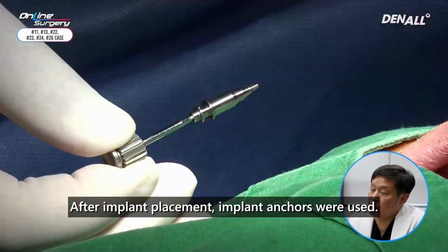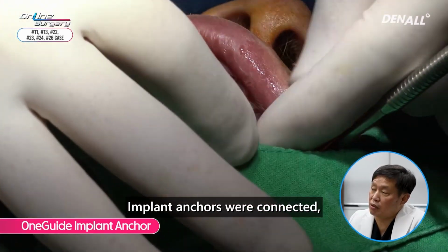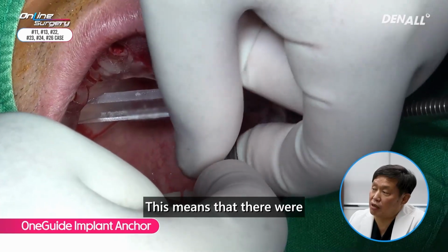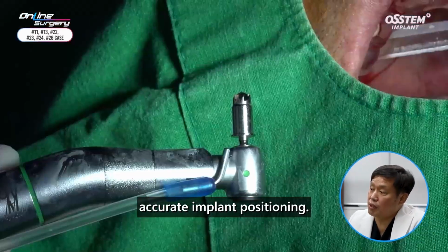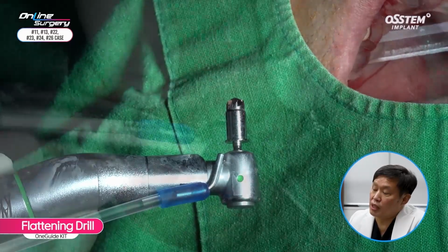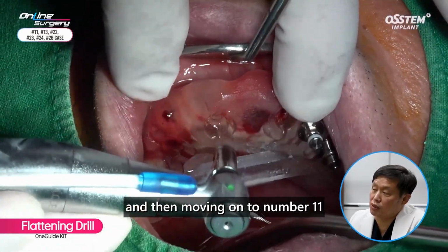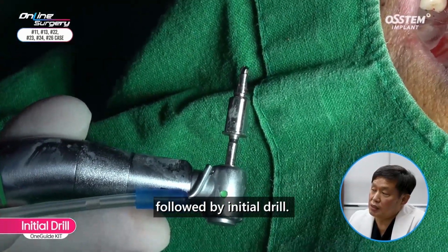After implant placement, implant anchors were used. Implant anchors were connected. Number 3 and 4. This means that there were 2 vertical anchors in order to ensure accurate implant positioning. Template was checked and then moving on to number 11, flattening drill was done, followed by initial drill.